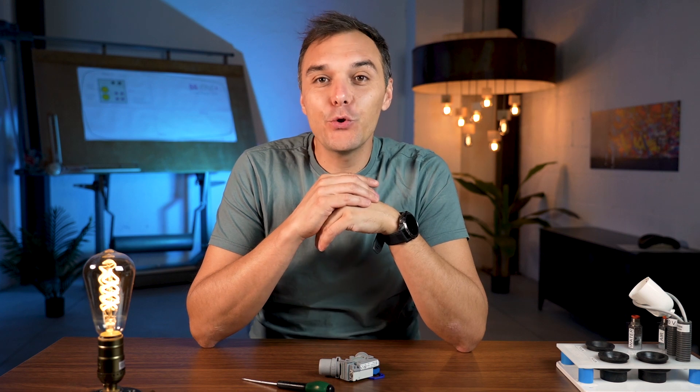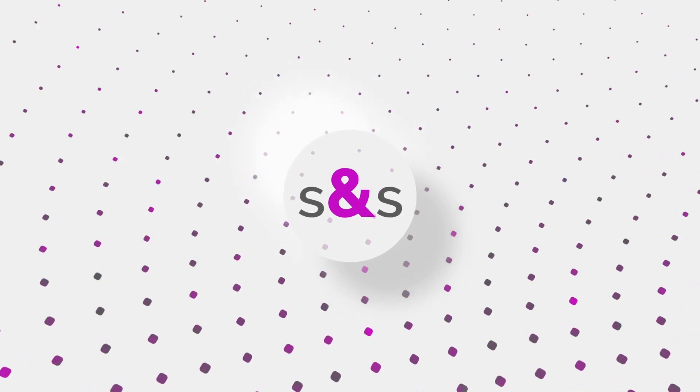Hello everyone and welcome to the Simple Smart YouTube page once again. Today I want to give some information about the selection valve that we use in our dental unit from DUR. We use a lot of DUR valves in our dental chairs because we found them very reliable, compact, easy to install and also to maintain.